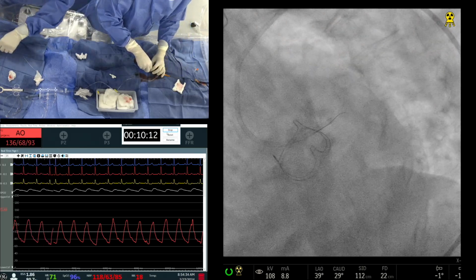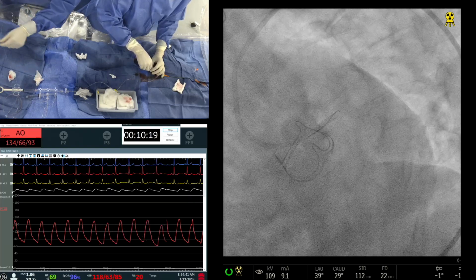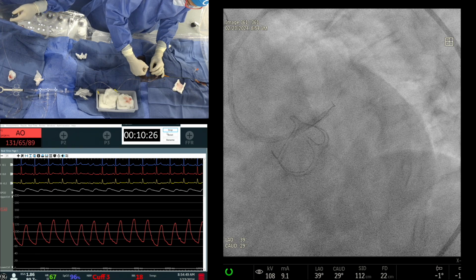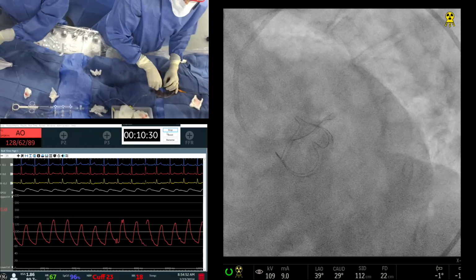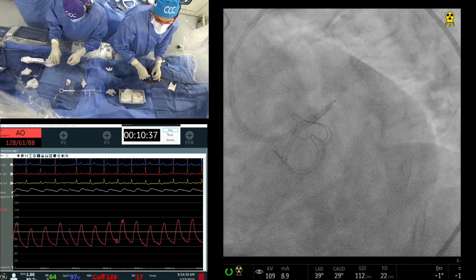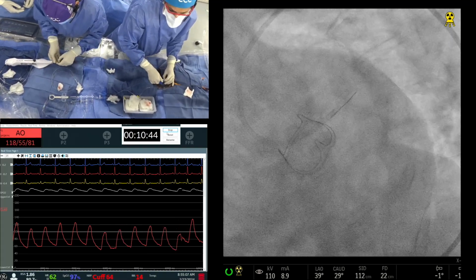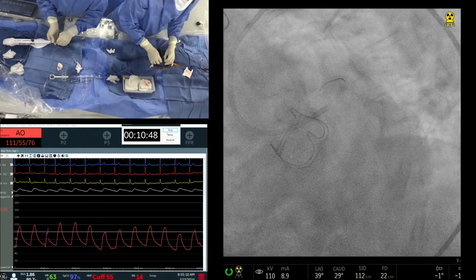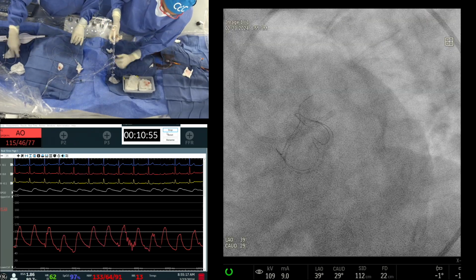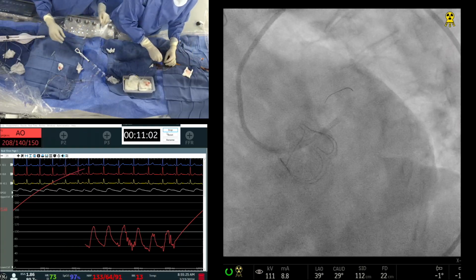Dr. Sharma sir, I think your decision to pick up IVL is based on how the balloon behaves in this lesion after you've done the ablation. Is that right? Yes. So I think one must keep IVL also handy. Yes. Yep, absolutely. This is a kind of case where, with IVL in such a lesion, although LV is normal, little hypotension may occur, but that's still tolerable because EF is normal. But if EF is low, IVL in unprotected left main, and if RCA was closed, would have been troublesome. But in this case, we said that we'll use IVL if necessary, but as an adjunct after doing the atherectomy, rotablation. So that is the plan. So before considering IVL, you definitely have to image and see what the rotaburr has done to the vessel. Yeah, that's right. Yes.